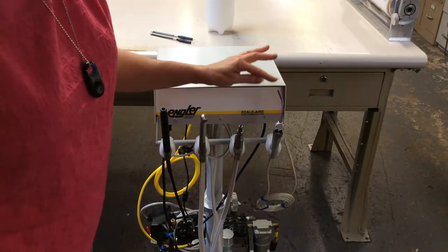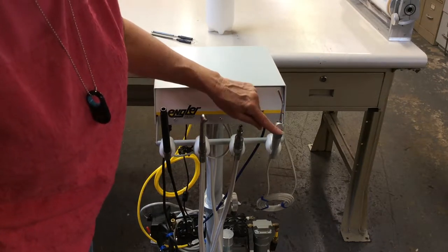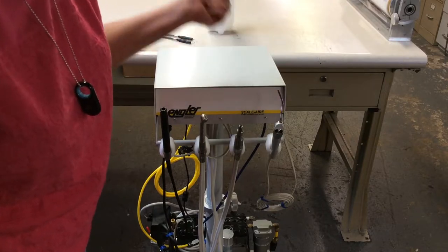The syringe hand piece has two buttons. The left one is for water, the right one is for air. If you depress both at the same time, you will get a mist.